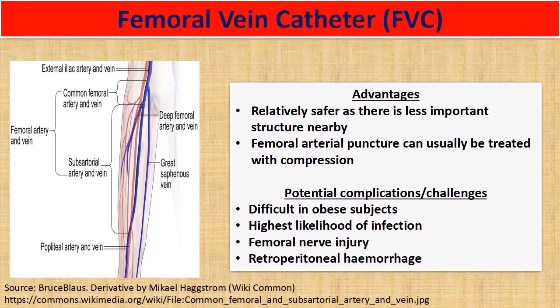Another risk or complication that we would consider is that femoral vein catheterization actually has a higher risk of infections because it is near the groin. Another risk would be femoral nerve injury or retroperitoneal hemorrhage, but these two complications rarely happen.